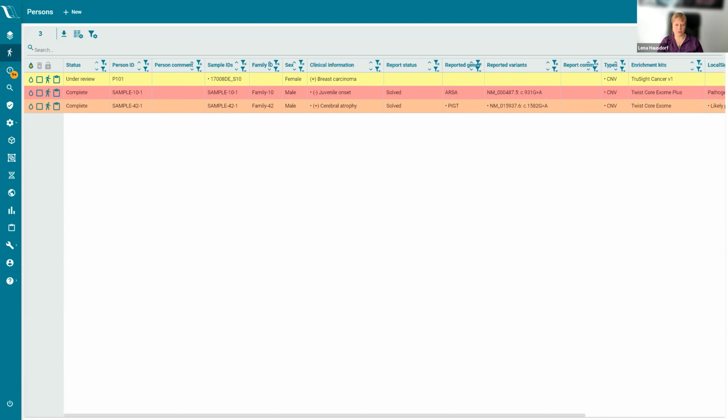There's a specific reason for that, because we are a medical device, and we are bound to extensive validations, and also to make it possible for the user to see absolutely transparently how the software actually got to this result.